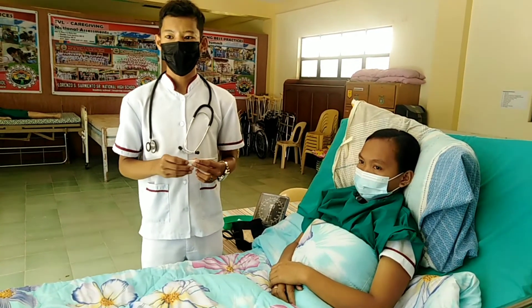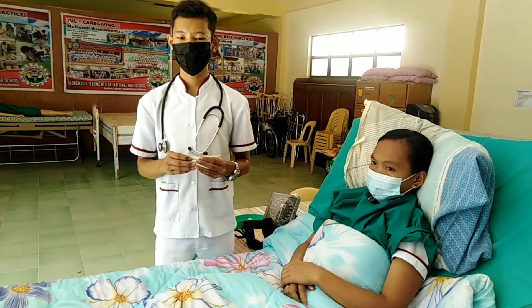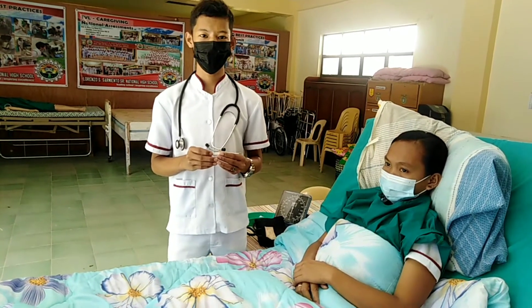Dispose of the equipment properly. Wash your hands. Replace all equipment in the proper place. Record in the client's chart and give your signature, and report any abnormal reading to the senior staff.